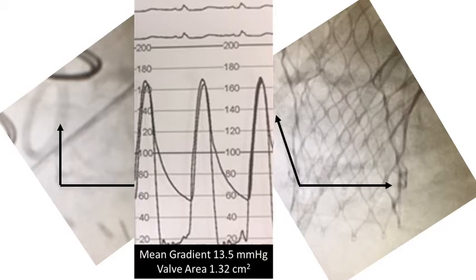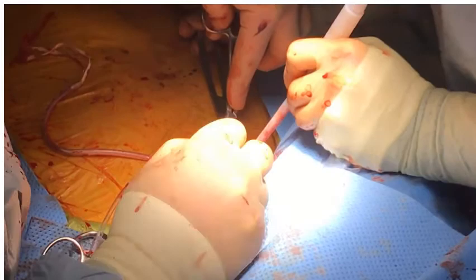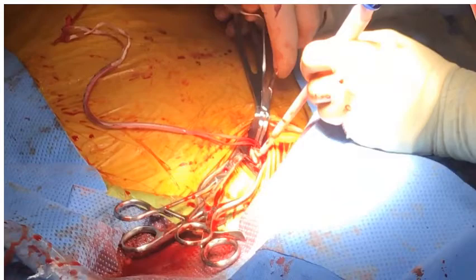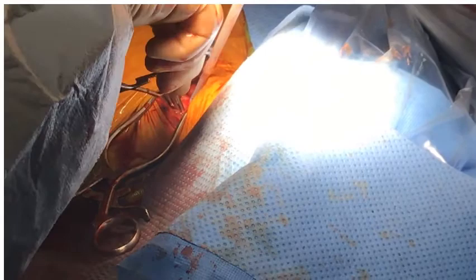This ultimately resulted in the residual gradient decreasing from 28 to 13 millimeters of mercury, with a valve area now of 1.3. The delivery sheath is then removed and the artery flushed. A side benefit of this technique is inherent embolic protection for the brain on the access side. The transverse arteriotomy is closed primarily, and after releasing the proximal clamp, we de-air with a 25-gauge needle and then re-establish flow to the brain.